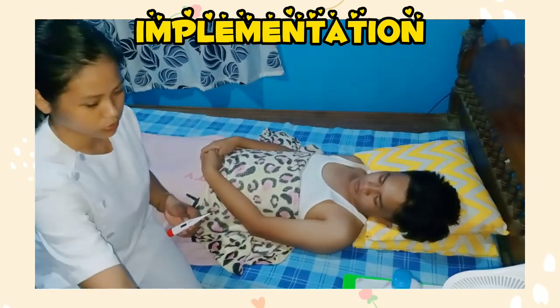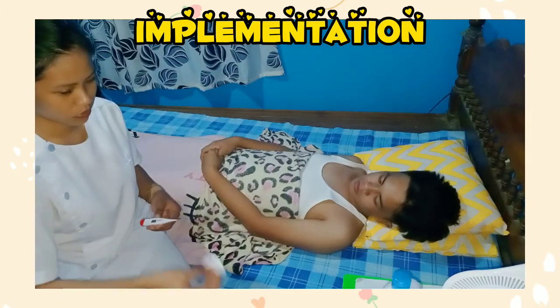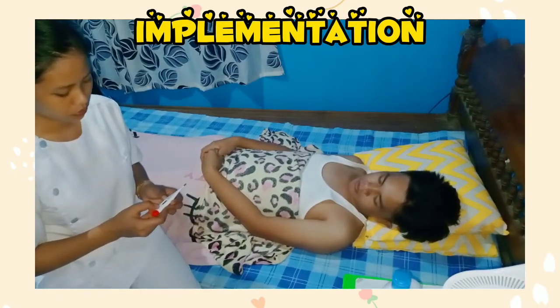Clean the thermometer and place the thermometer to appropriate route or site.